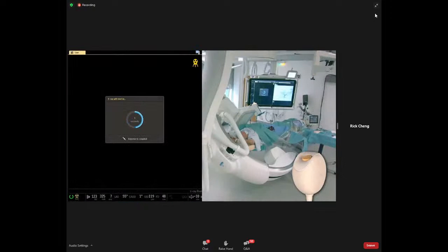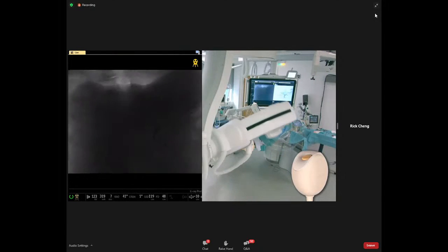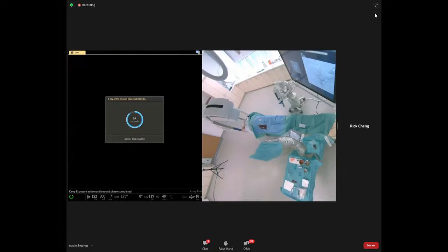The cone beam CT starts with an X-ray delay. During this delay time, the contrast injection is already starting to have a perfectly filled vessel tree. The images of the arterial phase are sent in real time to the interventional work spot.